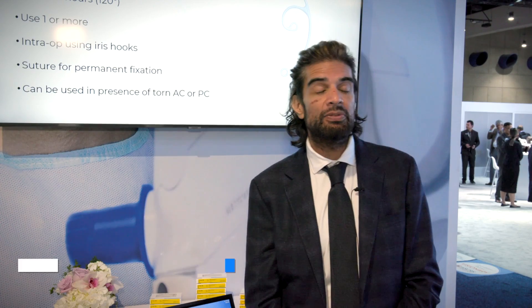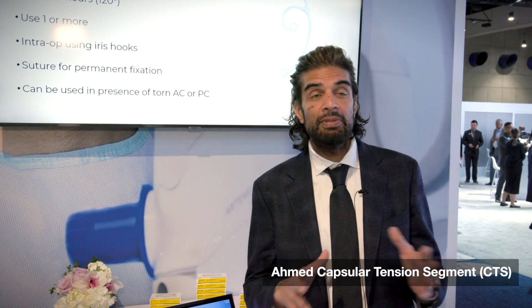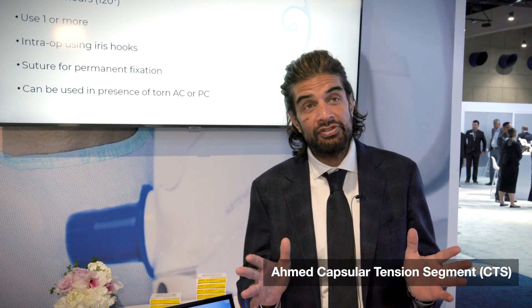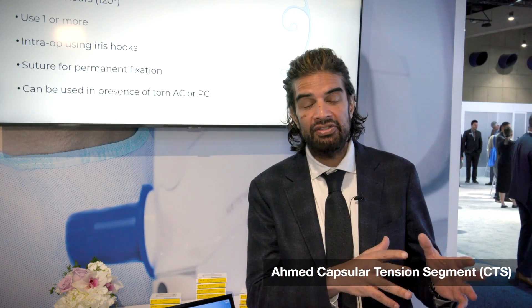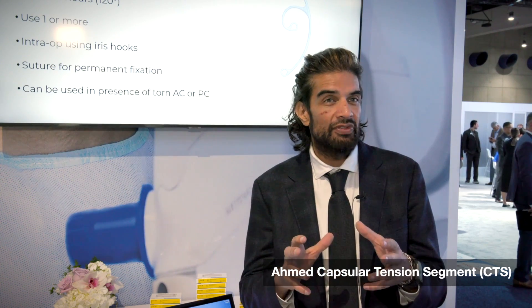The 6D and the 6E, both capsular tension segments, are used for more severe zonular dialysis. That's to use a measurement of zonular support. This can be based on the quantification of the dialysis — usually more than four or five clock hours — and/or the amount of phacodenesis, so both quantitative dialysis and more qualitative assessments of zonular strength.